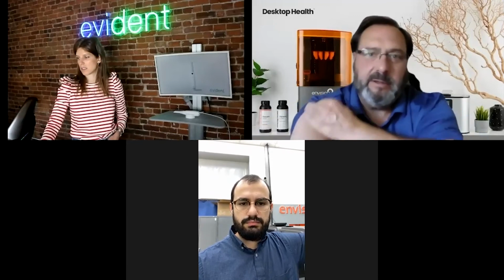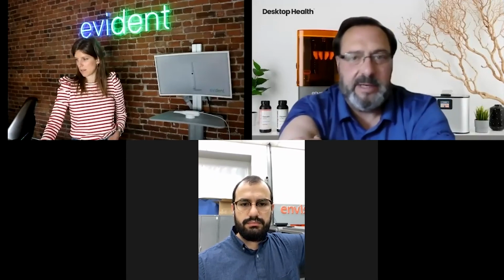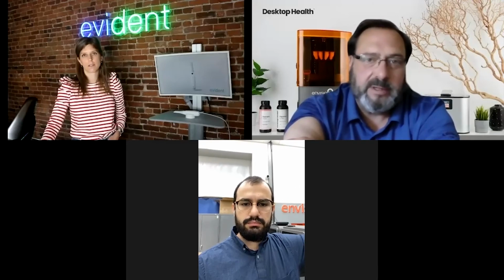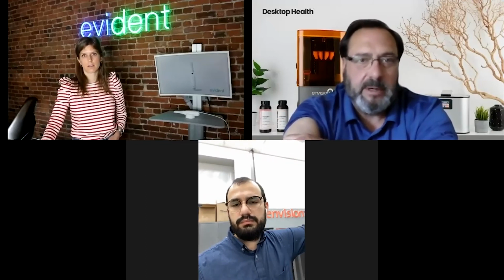It's $500 US a liter. Okay. Right. And then the Smile is $600 US a liter. So when we print out a denture, a full denture with the teeth, a full arch with the teeth and the base is around $12 US printed in material cost.